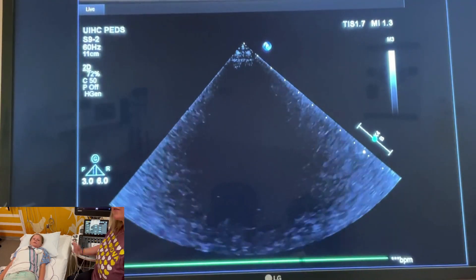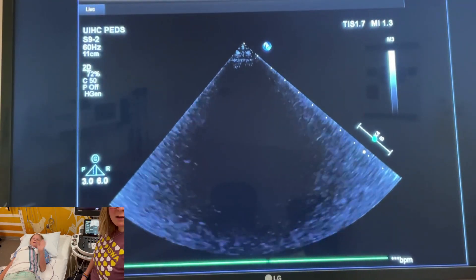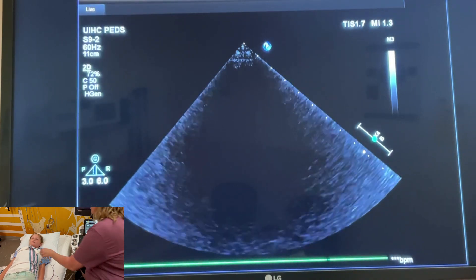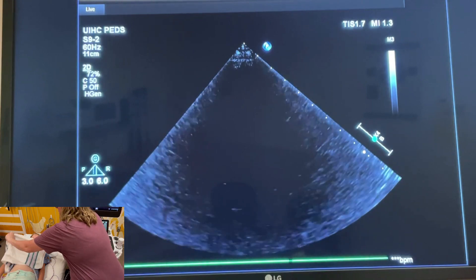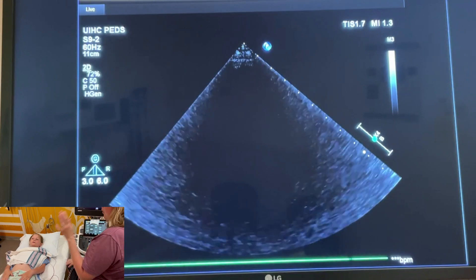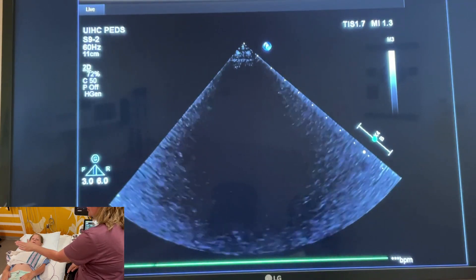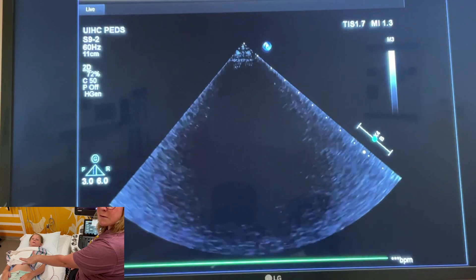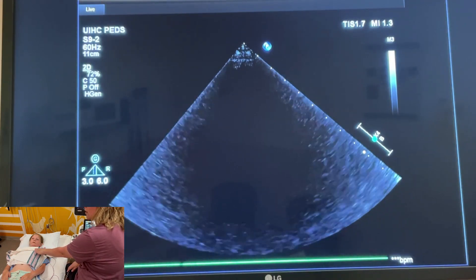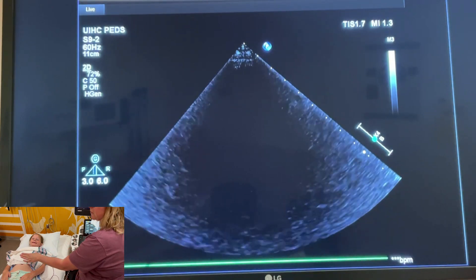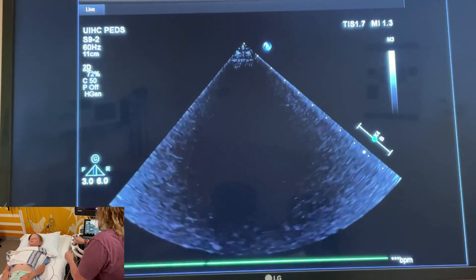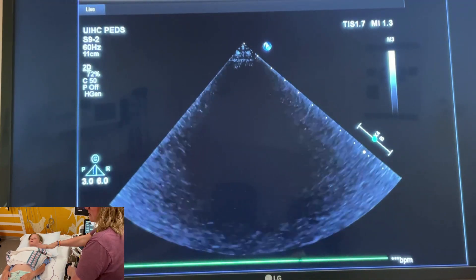Hello, my name is Christy Crow and this is my lovely assistant Eleanor, my daughter. We're going to be going over subcostal imaging to start. You'll have the patient prepped with three leads on. The rule of thumb I use for subcostal imaging is whatever transducer you're going to use on the parasternal long, you would go lower in frequency for the subcostal because you're trying to penetrate through more tissue. In a childhood age we would use an S9 probe, but for subcostal views I would probably go up to the X51C just to get better images.